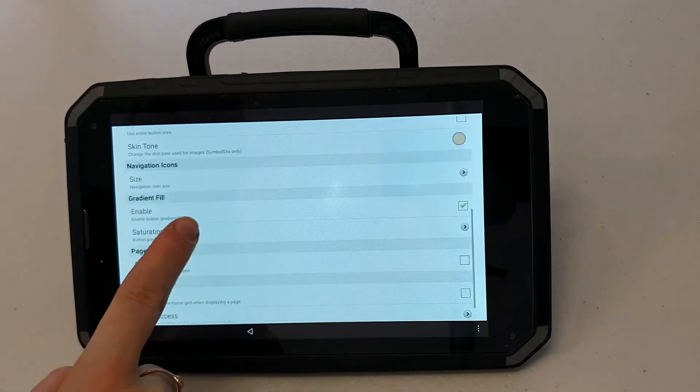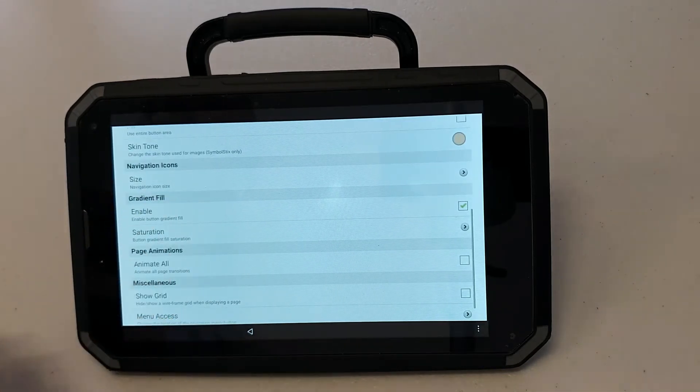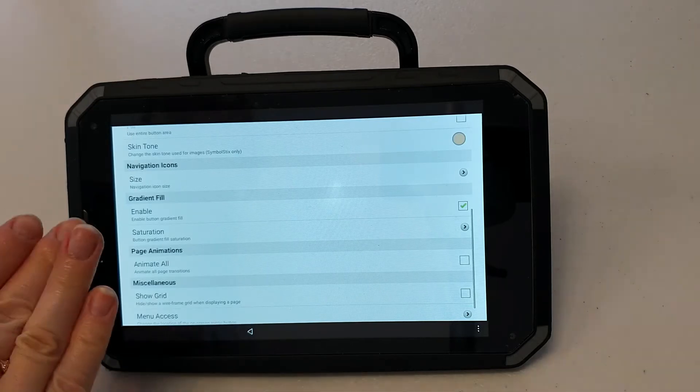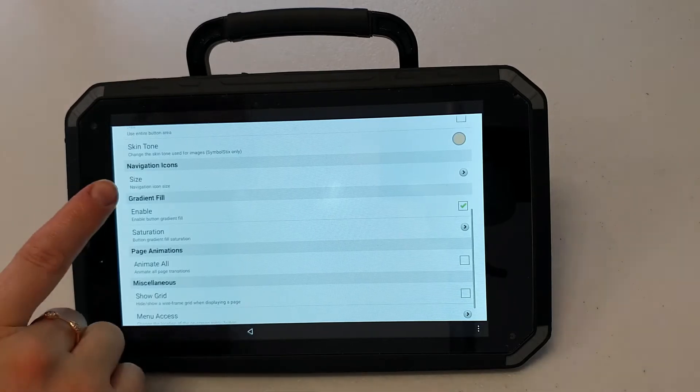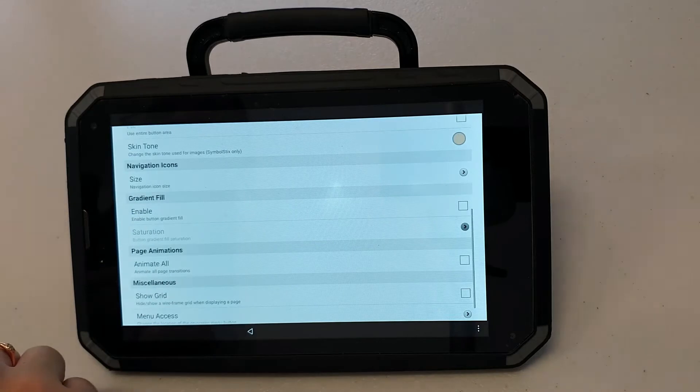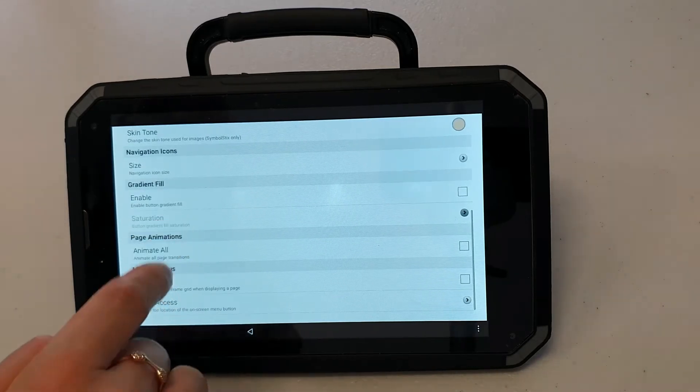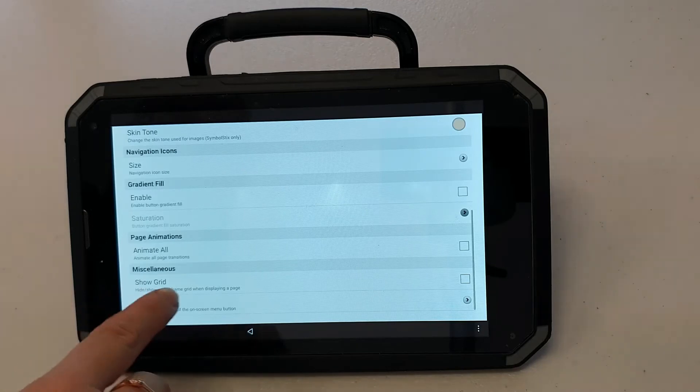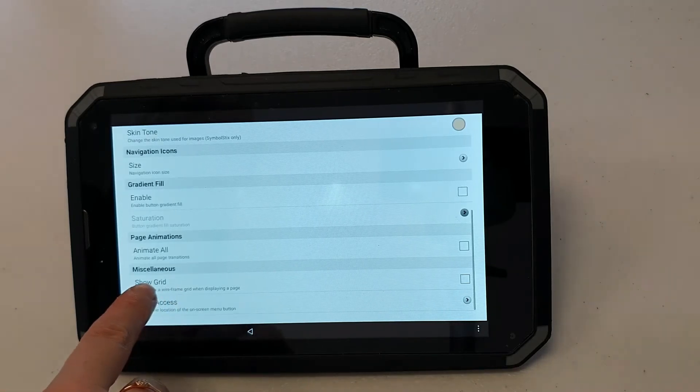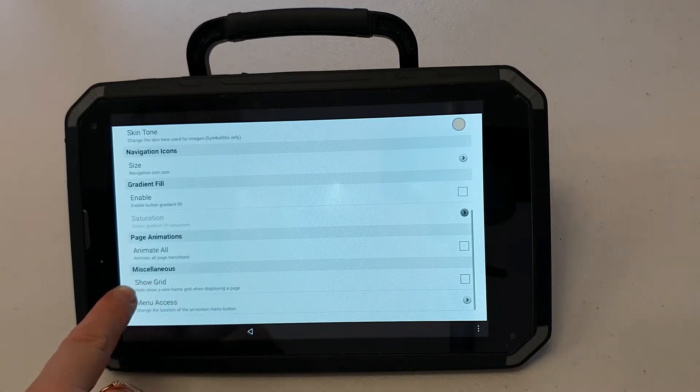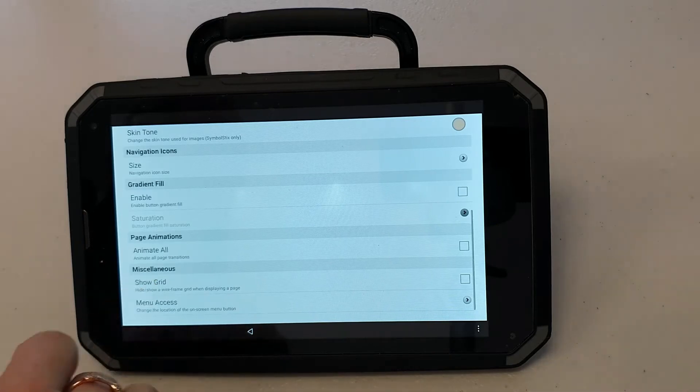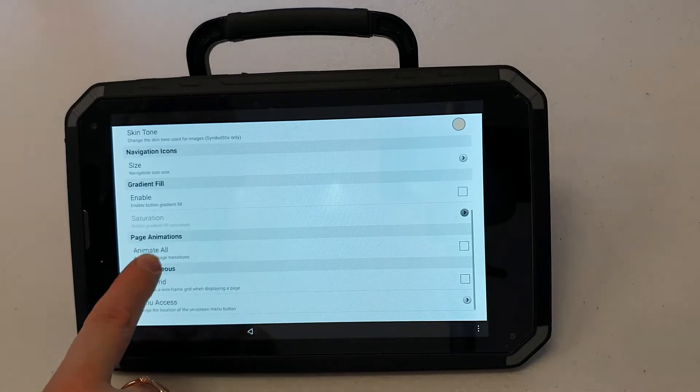You'll also notice that the buttons are gray or they have a slight shadow to them. If I want to turn this off I can disable gradient fill. If you are currently using the LAMP Words for Life app and you would like a grid to appear on your home screen you can press show grid in order to enable this.